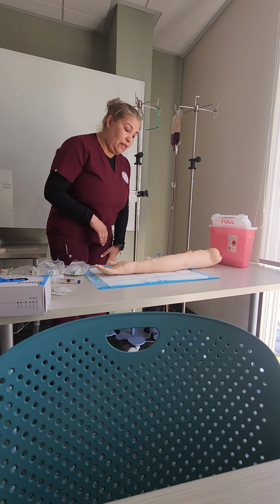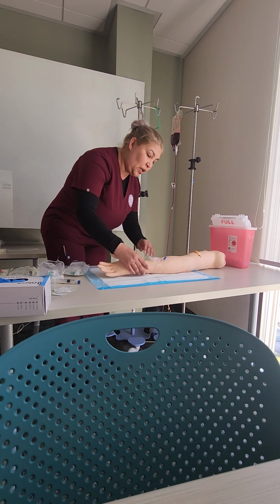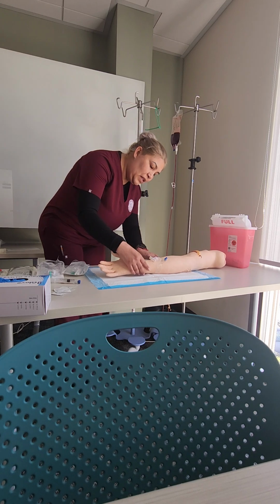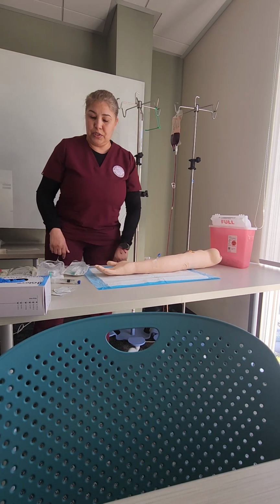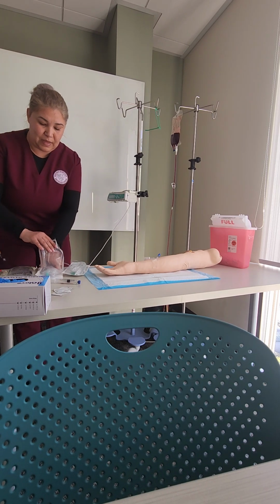And I want to evaluate the IV site. So what I want to do is make sure, and talk to my patient through this process, that there is no redness, that there is no swelling, that the IV is fully intact and there is no bleeding. The IV looks good. What I will do now is I'm going to hang my primary IV bag.